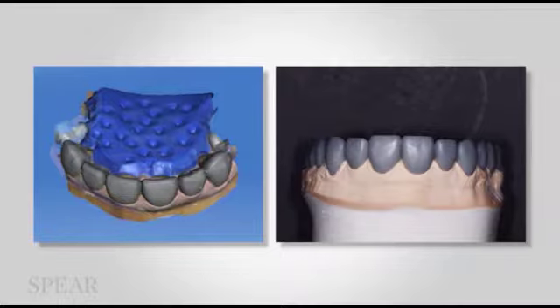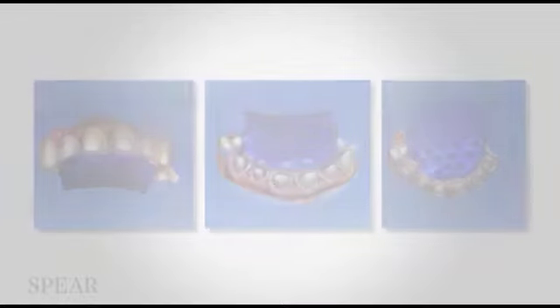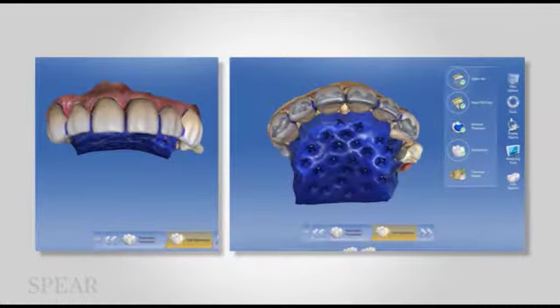And that model that I was wanting to use as a biocopy was so different from her dentition to start with, that I just basically made a little putty on her model and then put a whole bunch of little data points in there. I did it on the model first so that I scanned that in as the biocopy, so that now when I'm going to scan her preparations in, I take that same little putty that fits in her mouth just like it does on the model, and that's the beginning of grabbing the data points so that everything stitches together. So for those of you who are into this, I wanted to throw that out at you so that you'd know how that worked.